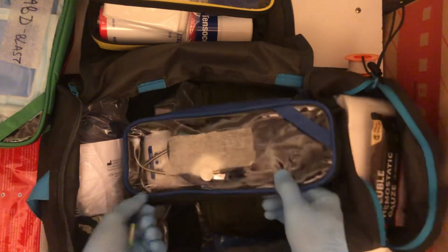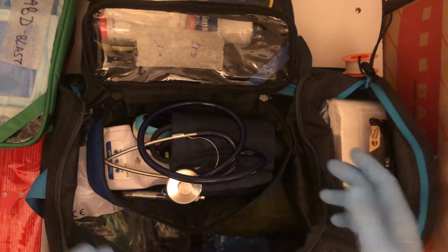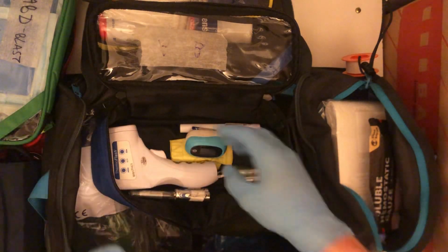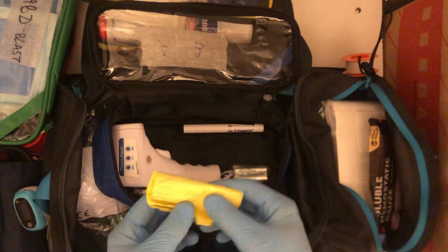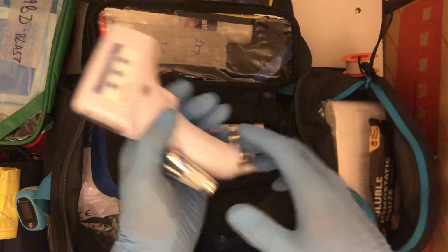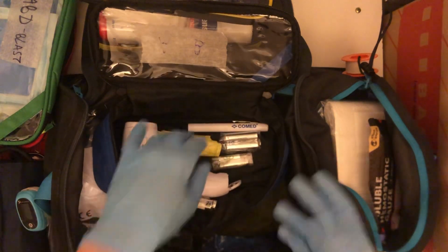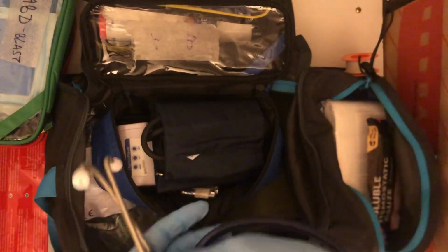Then we got diagnostics. I try to stay basic, as I'm not in the ambulance. I'm not going to do hemoglobin measures, stuff like that. I just got a cheap stethoscope, blood pressure cuff, adult size. It fits everyone, you just have to adapt the readings. Then I got a pulse ox with the batteries. Bag for emesis, so puke basically. Then I got additional batteries for everything, a digital thermometer, and a pupil light. The only thing I don't have in here is my glucometer, which is actually in my car kit. When I have lots of people at home or a known diabetic, I just switch its place because they're pretty expensive. There you go for the diagnostics.